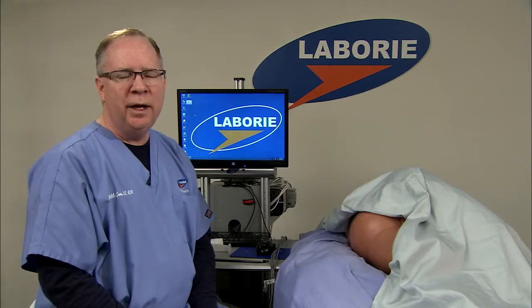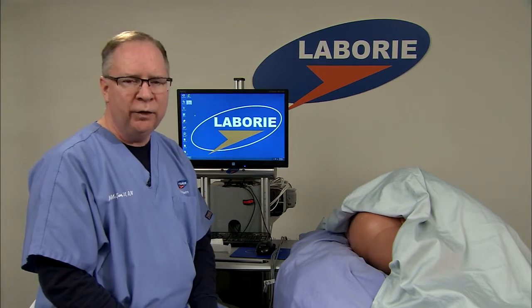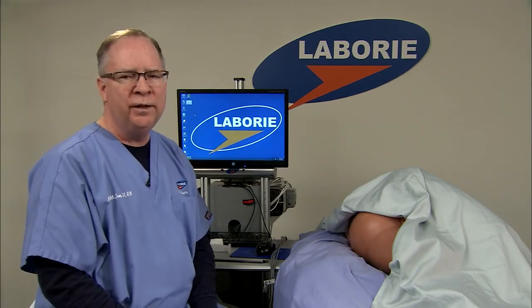The test is pain-free. There is no discomfort with it. There'll be various sensations, but it should not be uncomfortable. And also, after the test, they will be able to return to their normal activities. No restrictions afterwards. The patient should then be escorted to the examination room, instructed to disrobe from the waist down.